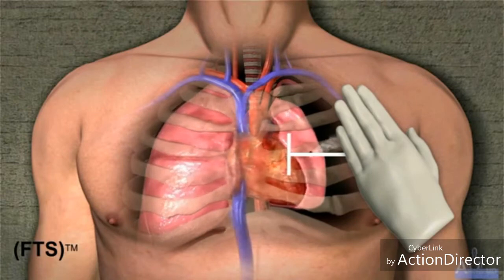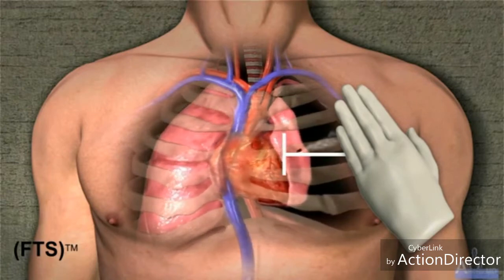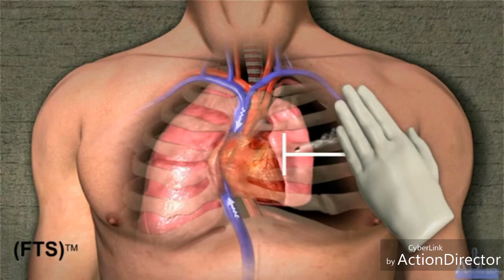This could impede venous return to the heart and make the lung and heart functionally ineffective, leading to circulatory instability and may result in traumatic arrest. Combining mechanically supporting ventilation with occlusion increases this risk. Use of FTS is intended to prevent the development of a tension pneumothorax by releasing air pressure built up in the thoracic cavity via a one-way valve assembly.